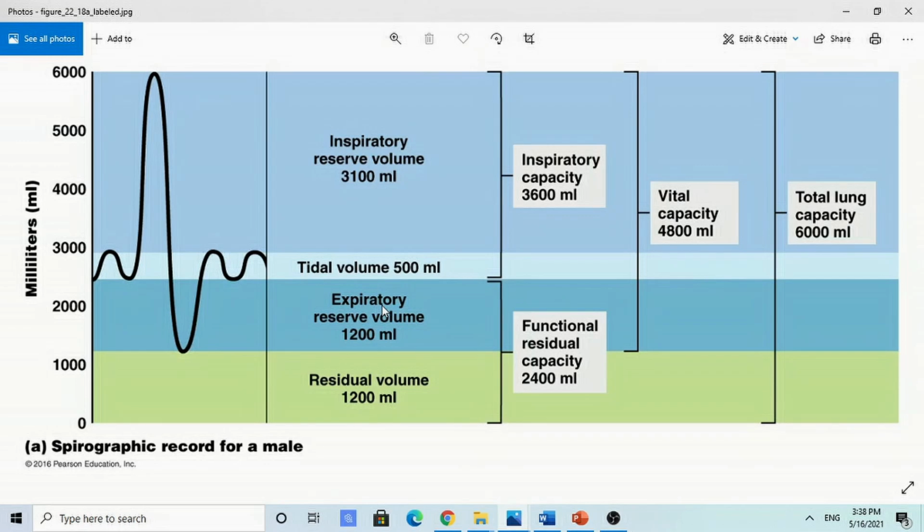To find out how much we breathe in, we use formulas. There are formulas which can be used to calculate the amount of air we breathe in, because we do not breathe from the machine, to avoid breathing in some dirt which might be in the machine. But we breathe into the machine when we do spirometry, which means we exhale into the machine.